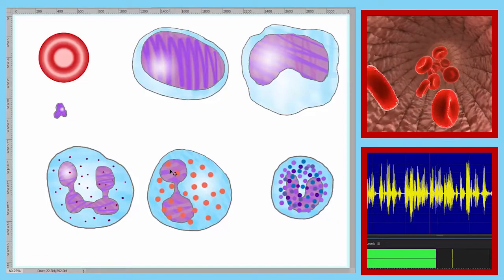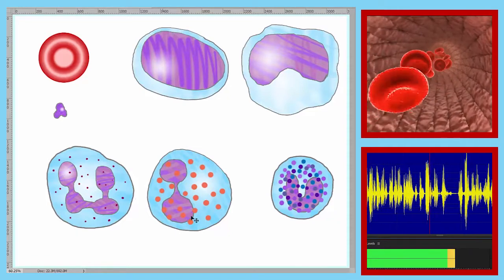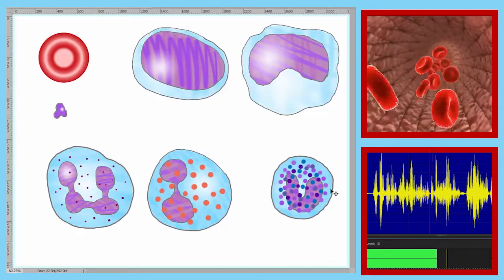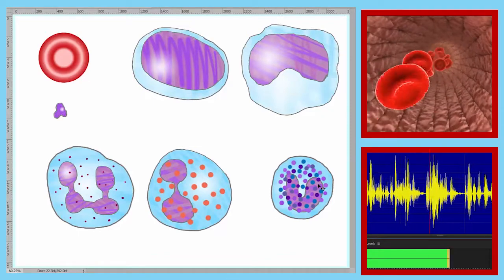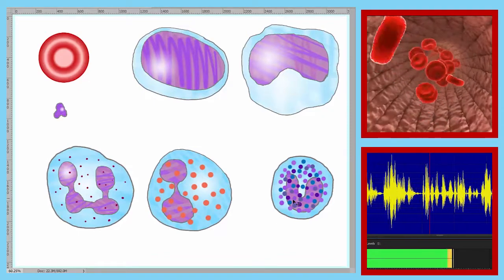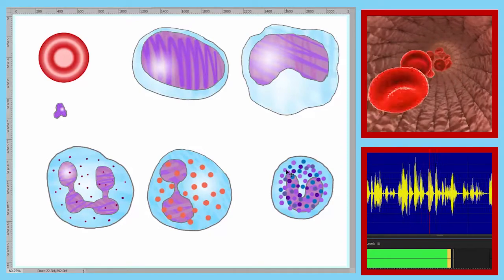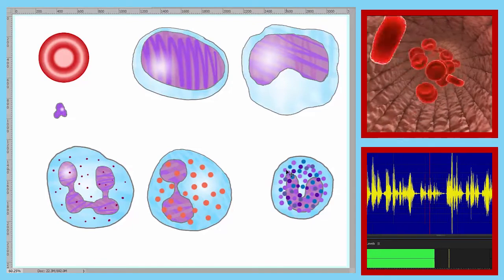Our sixth formed element, the nucleus has 2 lobes with orange-colored granules. And our final formed element is a little smaller than the previous two. It has granules, but it has so many large granules that they obscure the U to S-shaped nucleus. And these are all of our formed elements that we will see under a microscope.